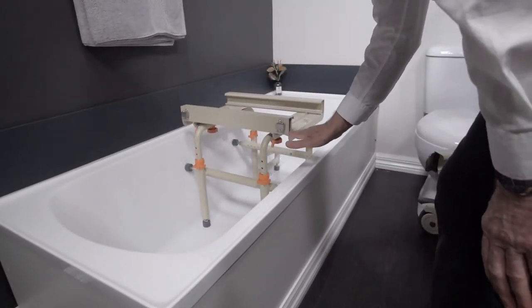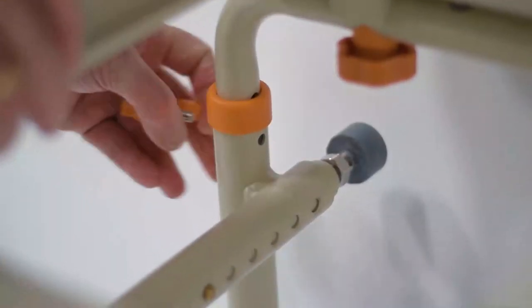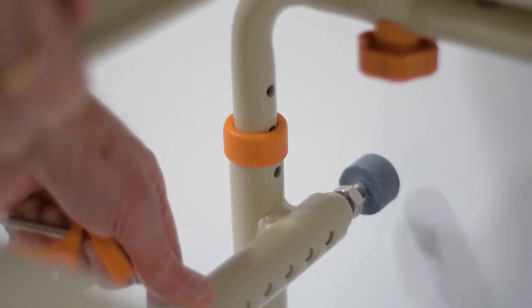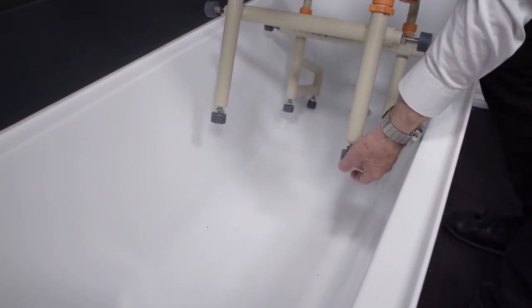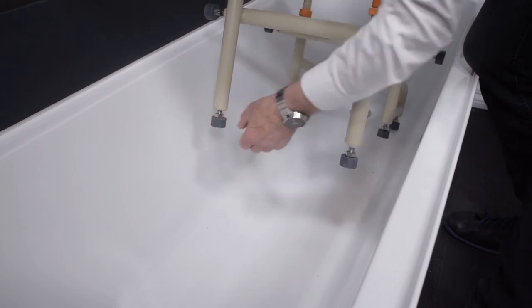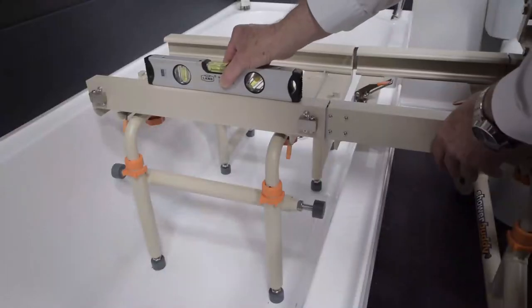When the chair is set to the correct height you can then set up the bath base height to align exactly with the chair and bridge. Make the first major adjustment at the height adjustment clips where the height is adjustable in set increments of 25mm or 1 inch. Get the height adjustment as close as possible then use the micro screw adjustments at the feet to align exactly with the chair and bridge. When the alignment is 100% straight and level you can lock off the nut securing these rubber feet.